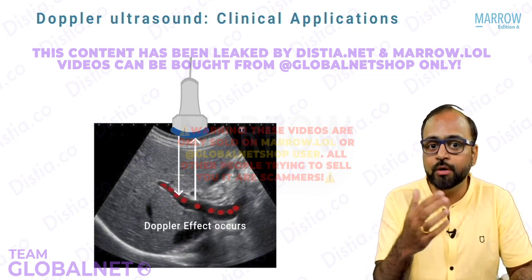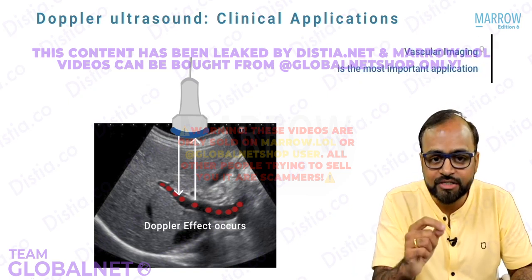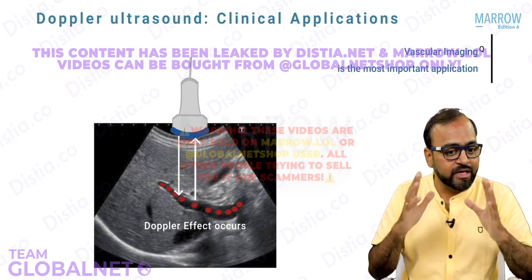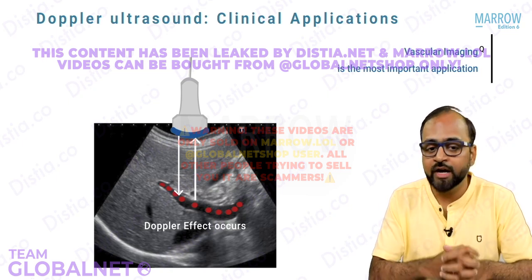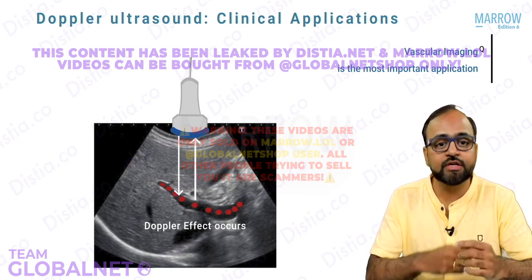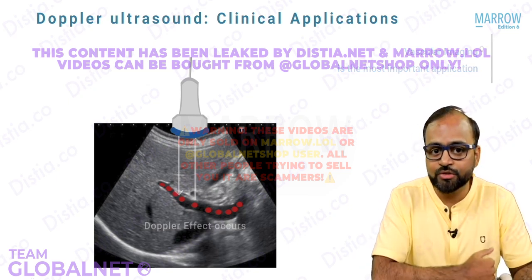Do you get the clue about the application of Doppler? Where is Doppler ultrasound used? Therefore Doppler ultrasound's most important application is vascular imaging. So it helps us detect the blood flow, the direction of blood flow, and the velocity of blood flow. And using this information, we can diagnose thrombosis, stenosis, flow alteration patterns, insufficiencies on various Doppler studies. That is the beautiful application of Doppler.